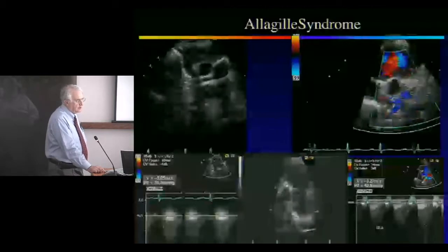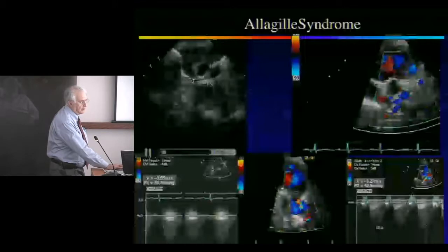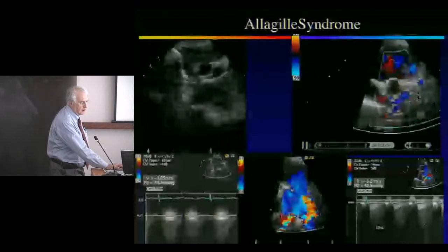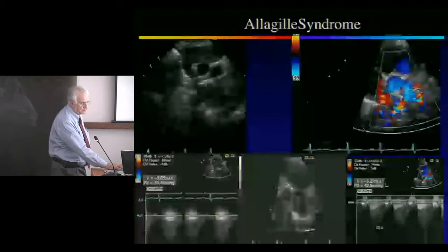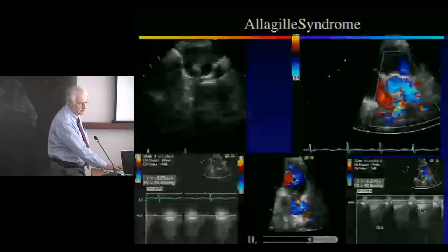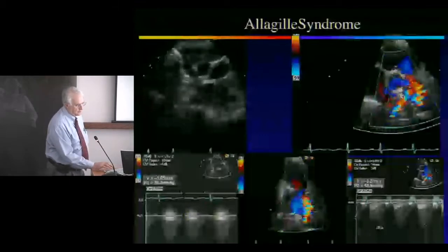And you can see here a quite profound degree of peripheral stenosis of the right pulmonary artery from a high three-vessel or high parasternal view to a regular view showing the left pulmonary artery and the right pulmonary artery being equally small. And then the velocity gradients here determining the peak velocity, and there the velocity in the main pulmonary artery clearly showing the acceleration occurring above the position of the valve without valvar stenosis.